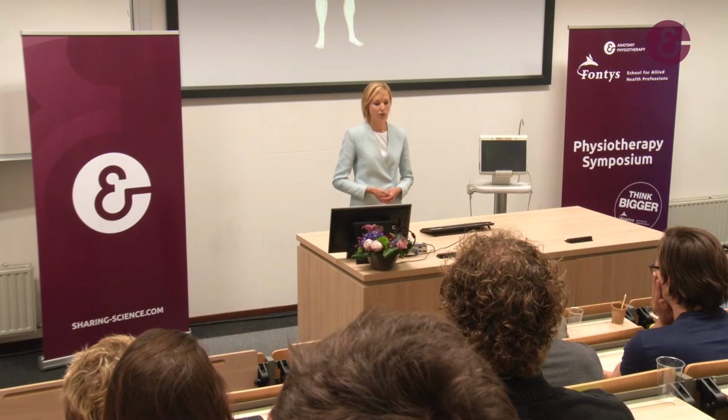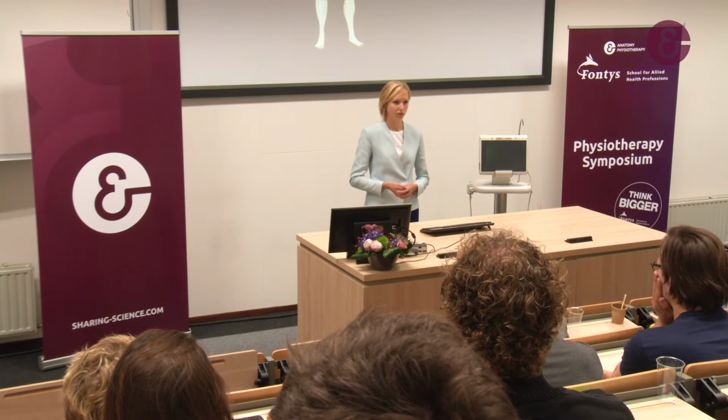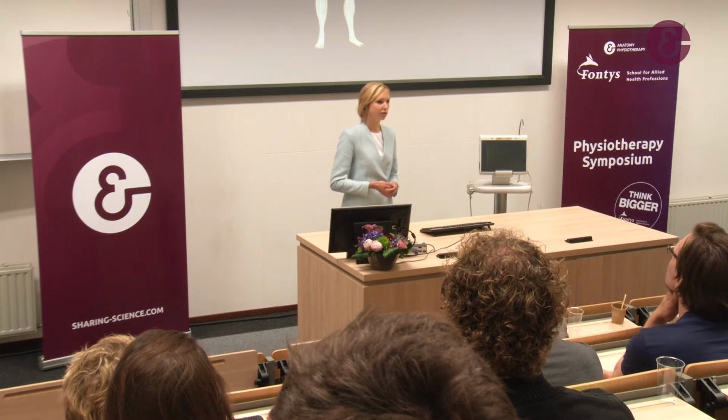This scenario is all too common among physiotherapists, and to combat it, musculoskeletal ultrasound is being used increasingly as an extension of the physical exam to provide real-time information on the level of body functions and structures. Tendons in particular are very suitable for ultrasound examination due to their high contrast with the surrounding tissue. But anyway, back to Ben.